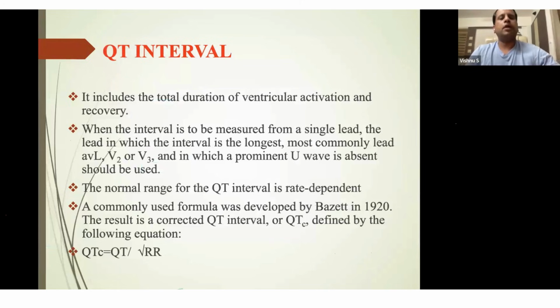So what is the importance of the QT interval in our clinical practice? Because the QT interval is usually prolonged in two or three clinical scenarios you usually come across. One is electrolyte abnormalities, the other one is drug induced, and the third one you usually come across is familial long QT syndromes. These are the three most common things you usually come across. In that, you have to take a detailed history if you find a prolonged QT interval in an ECG. And then ischemia, myocarditis, all those things are also there in the QT interval prolongation.